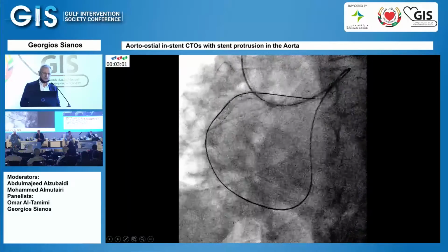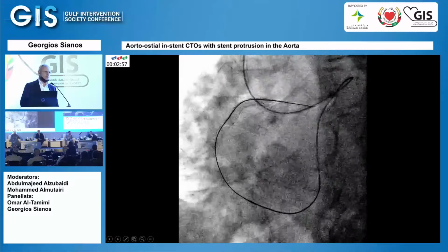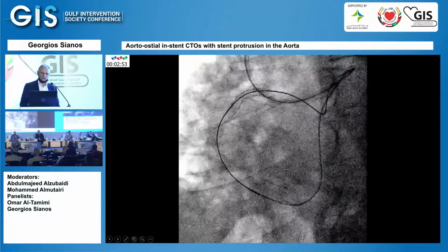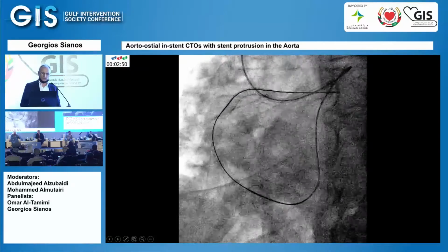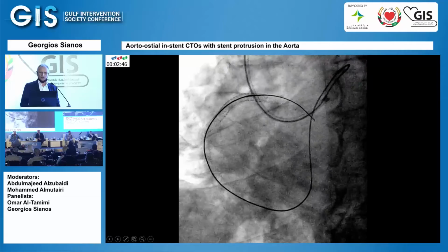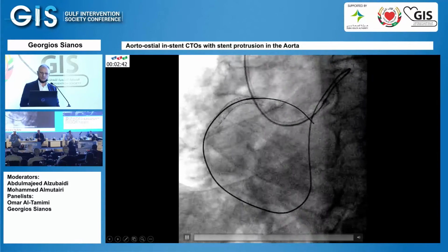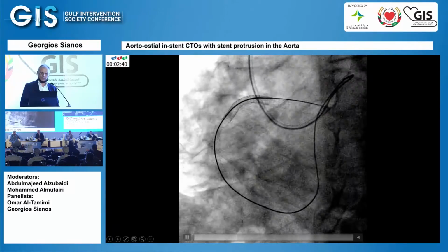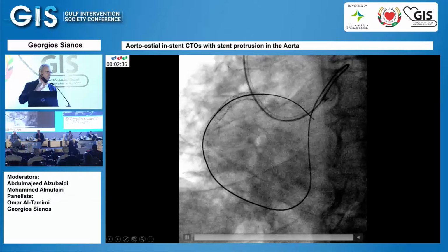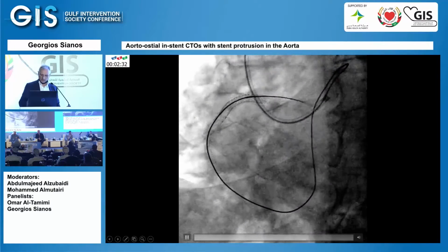The nice thing about stent is that when you really go outside, essentially you do not disturb the tissue inside. So the fact that we did a knuckle didn't cause any major dissection as far as it was outside of the caging. You see here where the stent is extending. You understand what I mean? But as you can appreciate, this wire actually went again from struts into the aorta, excluding, which is the key point, all of that part of the stent into the aorta.